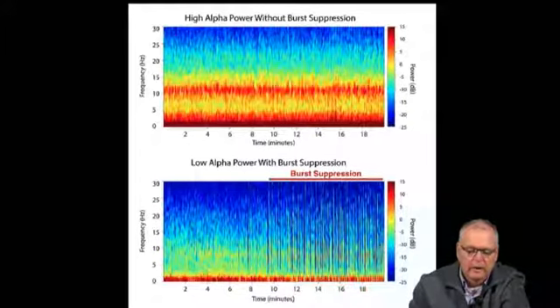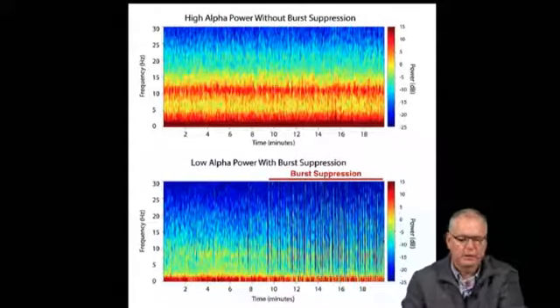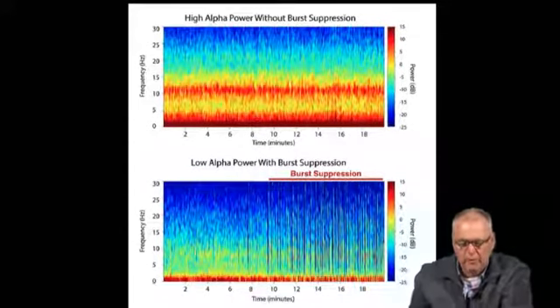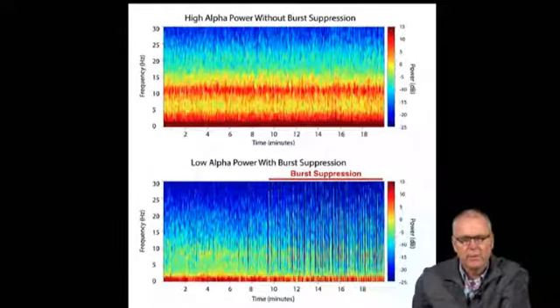And then they also noticed on the raw EEG some burst suppression here. So this is what I would say is a sicker brain. And I think being able to calibrate our eye to these spectral displays will help us be more rigorous in how we titrate anesthetics to things that matter.